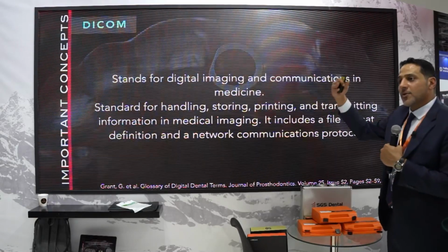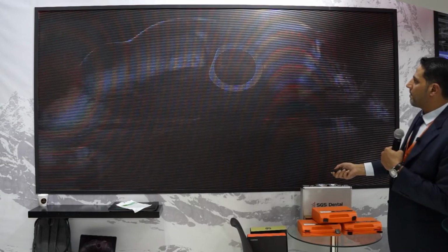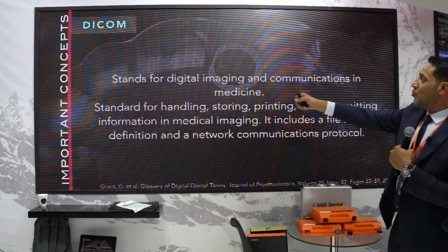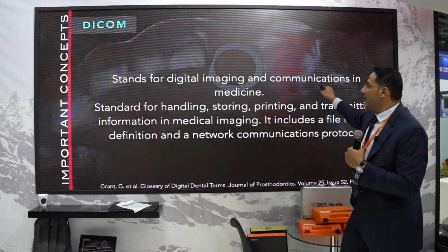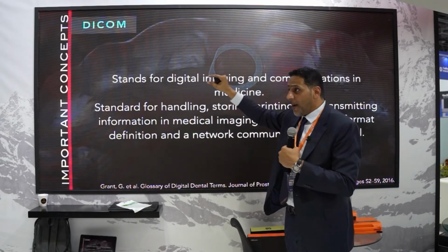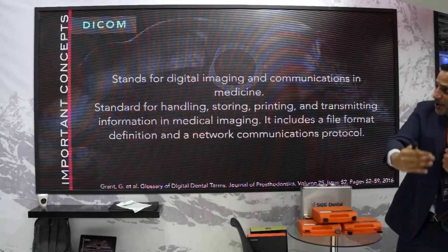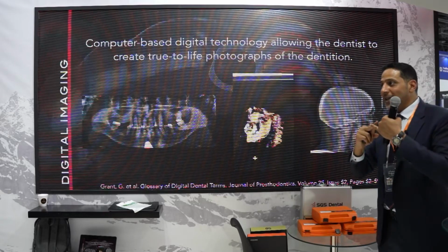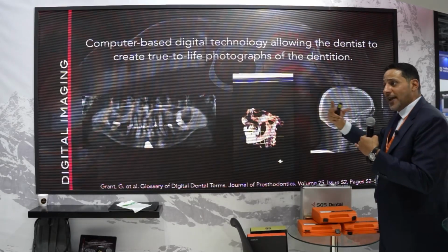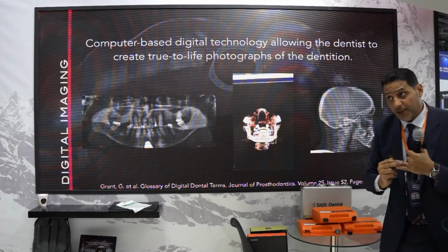The DICOM, which is the CBCT, stands for Digital Imaging and Communications in Medicine. This is the abbreviation of DICOM. Send the patient to take a CBCT. So the first one is the STL, which we can obtain by scanner. The second, DICOM, CBCT. Okay.